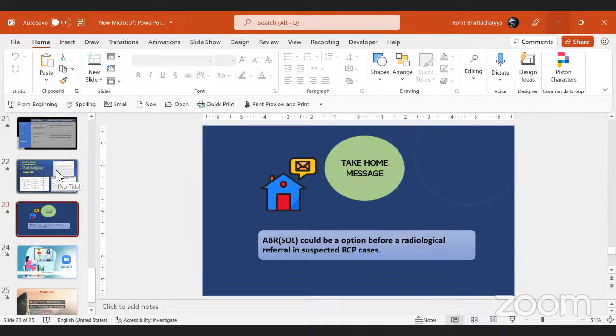Another question: the importance of supra threshold reflex decay. Dr. Mukherjee sir has asked about the importance of supra threshold reflex decay. And sir, I could not get the other word that you have written. That was recruitment. Okay. Yes, sir, the recruitment, sir.